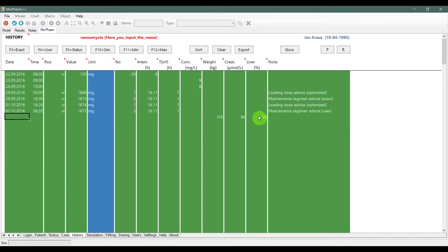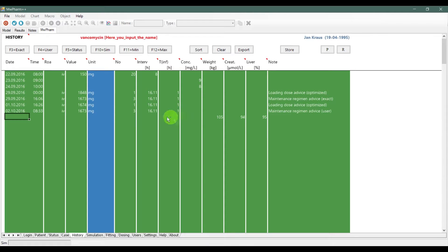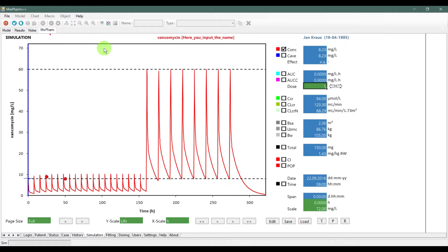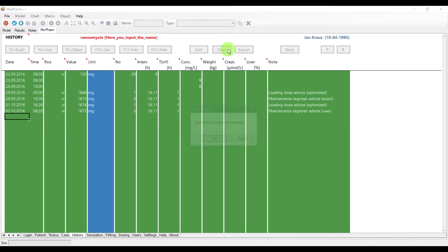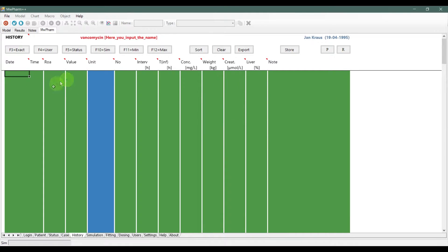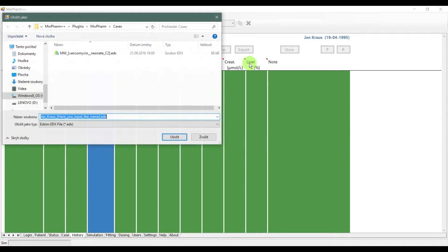Status button will input status info of the patient from the status tab. Sim tab will simulate your data. Clear will delete all the data in the history tab. Export will export your file with the data you input.